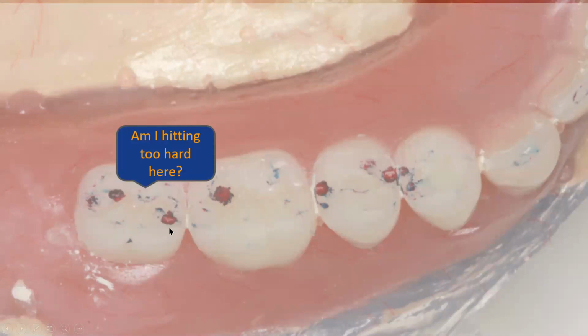That's why when you want to chop ice off a block, the ice pick has a very small, sharp point. It's not a flat surface, because big flat surfaces don't apply a lot of pressure. But small contacts can be extremely pressurized. And so there's no way to know if this small contact is high force or low force, and there's no way to know if this big contact is high force or low force. So there's a lot of missing information with respect to the amount of pressure that's being applied based on the contact sizes.